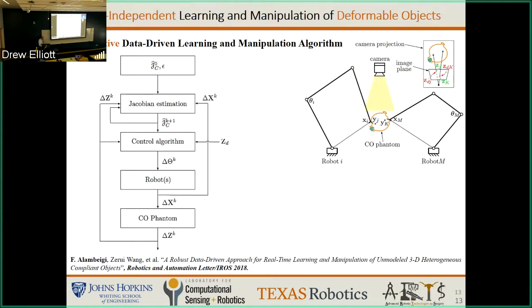But what I did during my PhD, and we are continuing with Munawar, actually sitting here in my lab, is look for data-driven approaches. But once I call it data-driven, it's not machine learning. We say if you can find some analytical approaches, where we know the input and output, input meaning that I have a robot manipulating the tissue and some information I can measure, can I find the mapping between this input and output, and somehow estimate the deformation locally and online with good speed, and simultaneously use it for manipulation? So the whole idea is here.